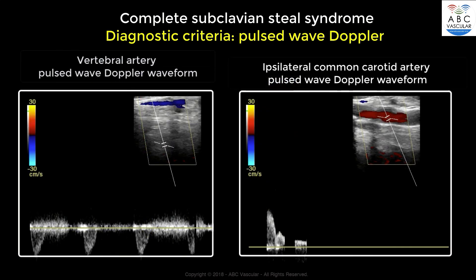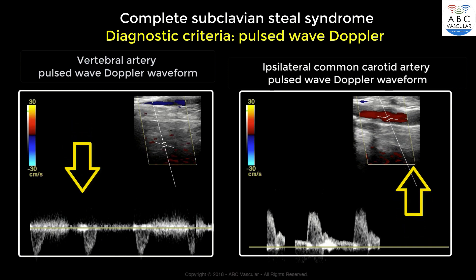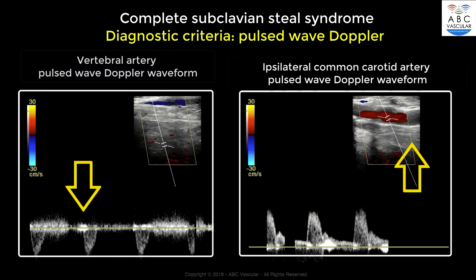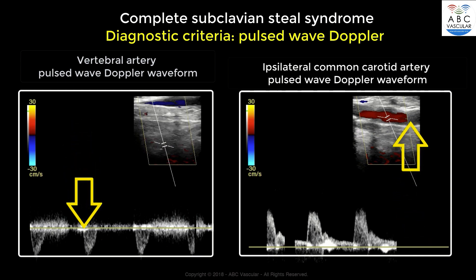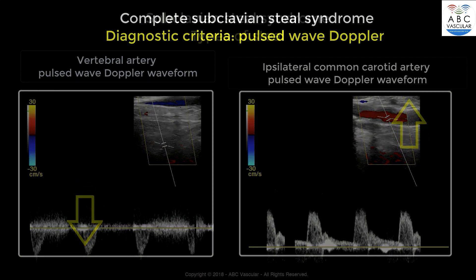When we compare the vertebral artery Doppler waveform with that obtained from the ipsilateral common carotid artery, we can see that the directions of the waveforms are opposite to each other. The vertebral artery waveform is below the baseline, while that of the common carotid artery is above the baseline.